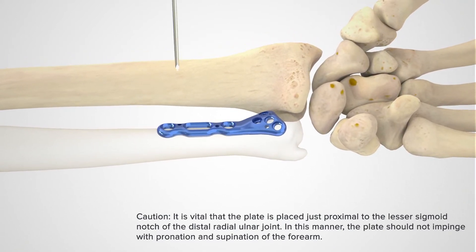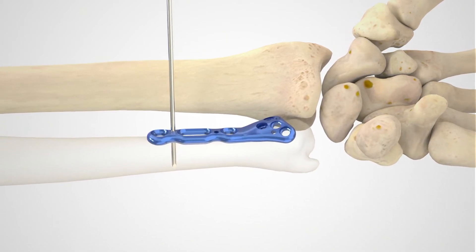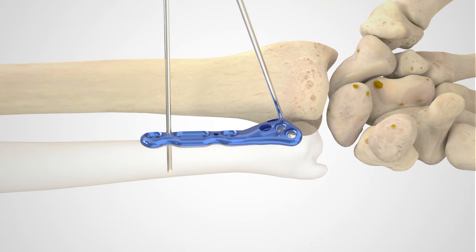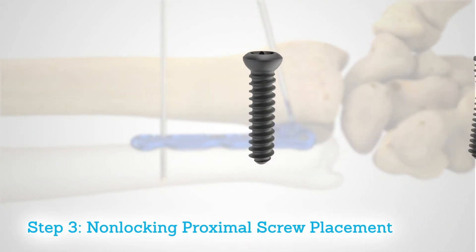The plate should not impinge pronation or supination of the forearm. K-wires are used to attain provisional plate fixation. Place a K-wire in the proximal portion of the plate, followed by a wire in the distal portion of the plate.